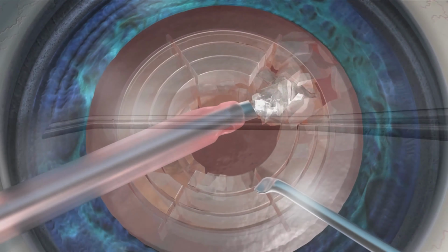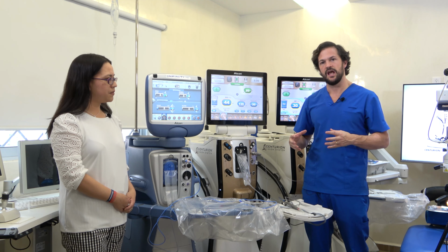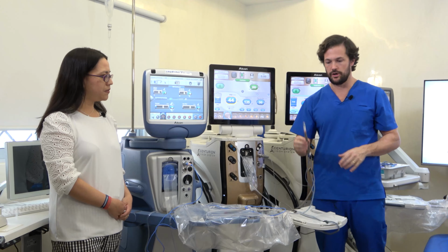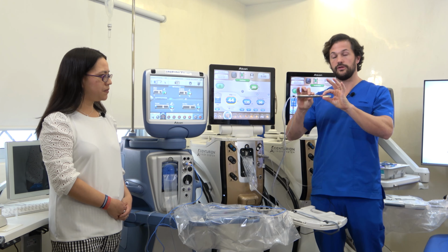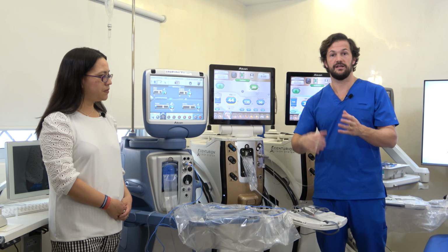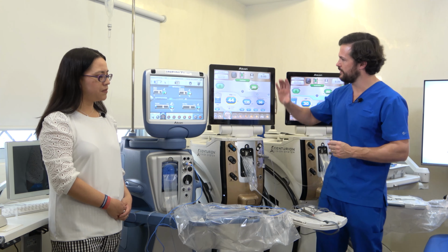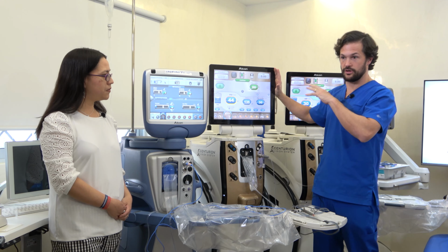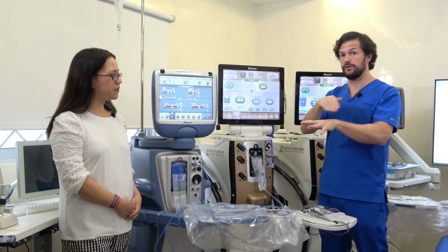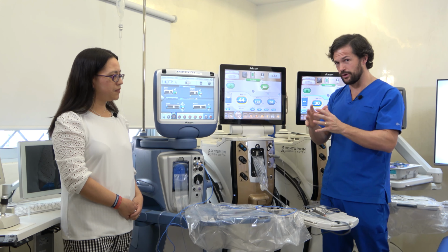And that always gives us a second important concept in Phacodynamics, and that is not only the parameters that are right here that matter. It matters the sleeve, the phaco tip, how well your incision is done, if the eye is myope, hyperope. There's many other factors that are going to be important in Phacodynamics. Again, ultrasound is what's going to destroy, or actually what's going to de-occlude the tip. Okay, that's the important thing.